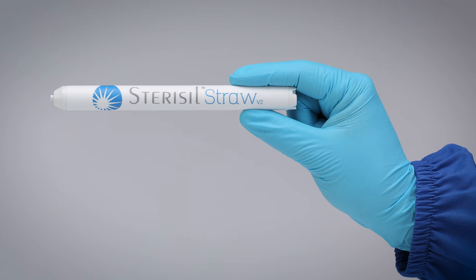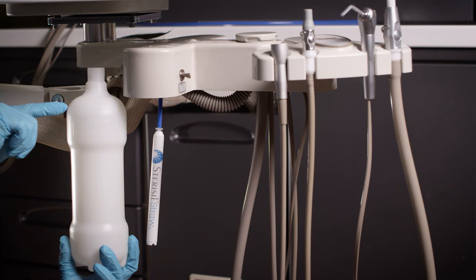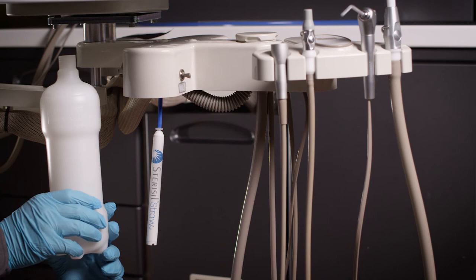Make sure not to overfill the bottle. Leave at least one inch of airspace at the top. This will allow for the appropriate airflow necessary to ensure proper pressurization.